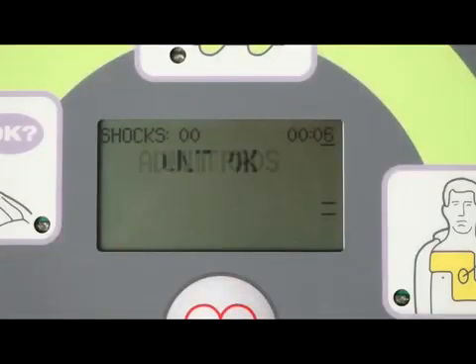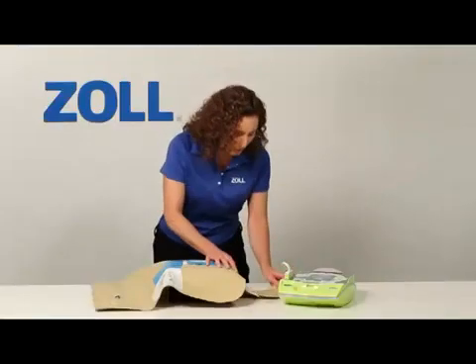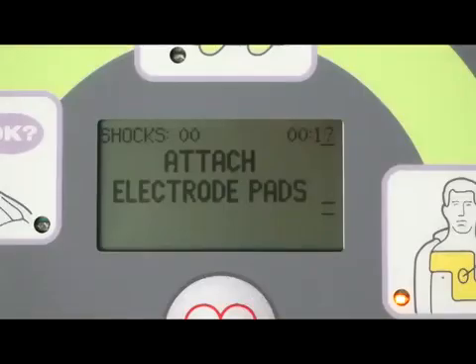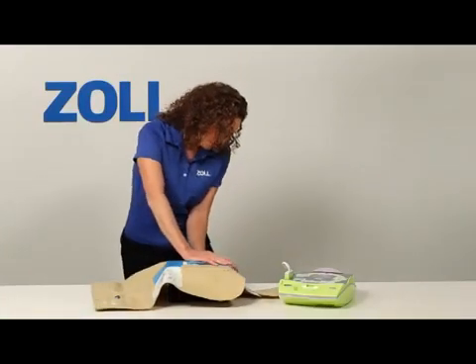Unit OK. Adult pads. Stay calm. Check responsiveness. Call for help. Are you okay? Are you okay? You, call 911. Attach defib pads to patient's bare chest.